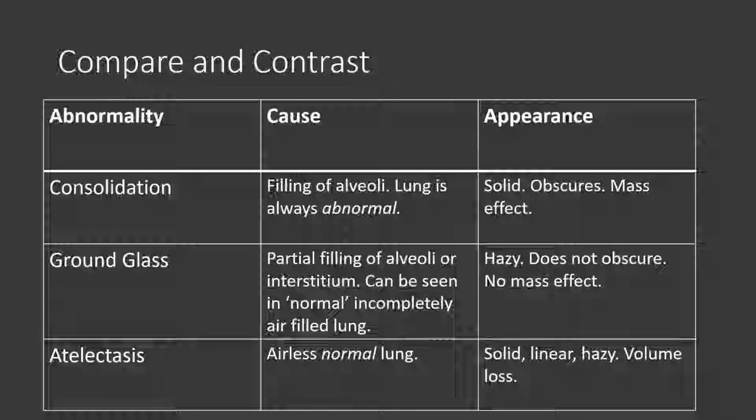Here is a summary slide that compares and contrasts the causes and appearances of each of these abnormalities. Feel free to pause the video now if you would like to recap what we had just discussed.